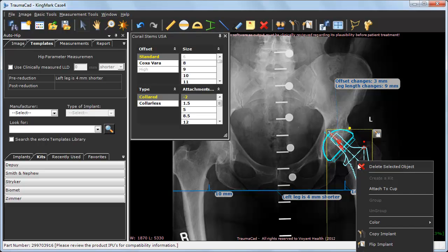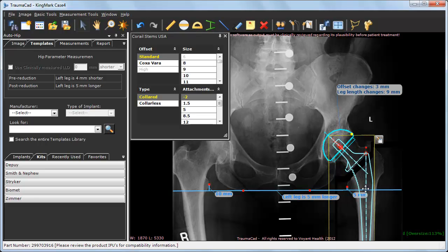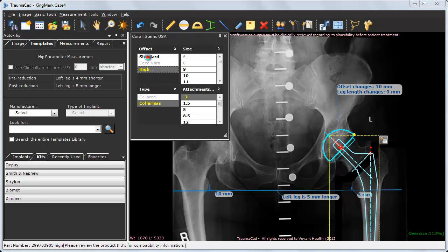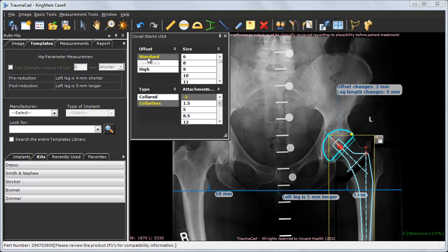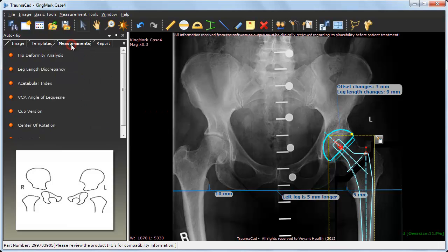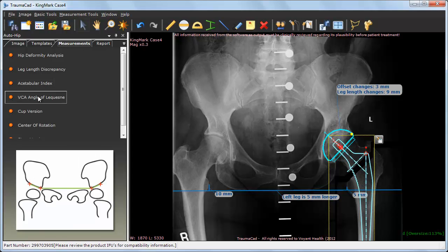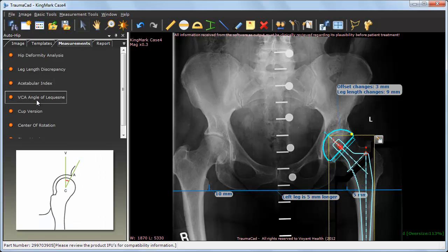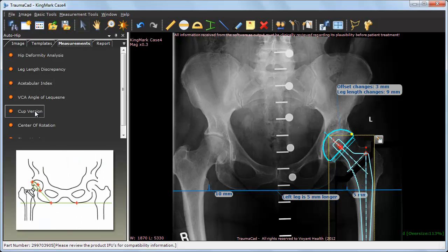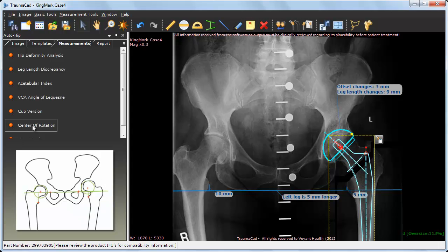Also, by attaching the stem to the cup, you may visualize the components alignment and joint reduction, as well as examine various implant properties. Of course, you may always go to the Measurements tab to use any other hip-related measurement tool, including post-operative measurements such as the cup anteversion.